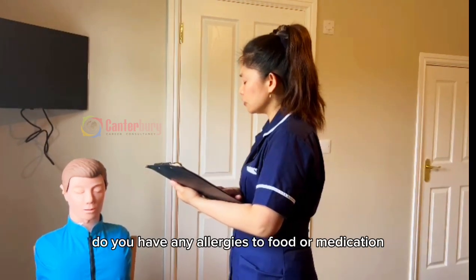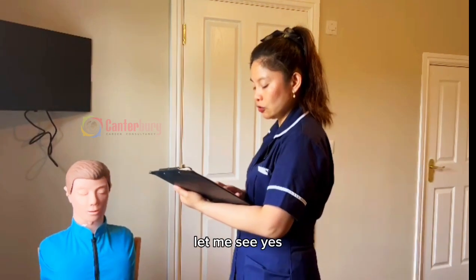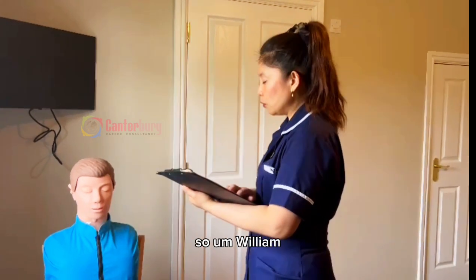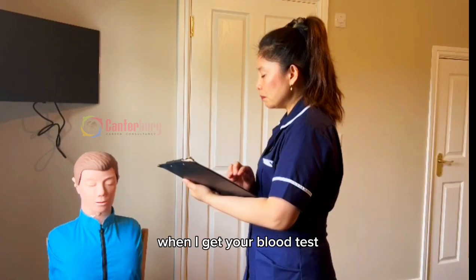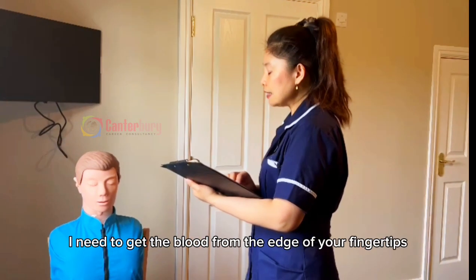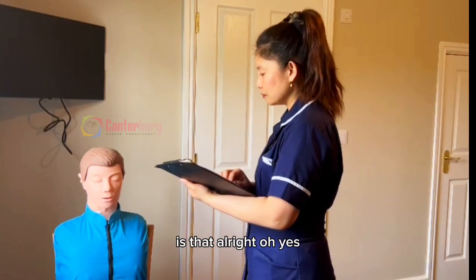By the way, do you have any allergies to food or medication? No. All right. You are not allergic to anything. So William, when I get your blood glucose test reading, I need to get the blood from the edge of your fingertips. Is that all right? Yes.